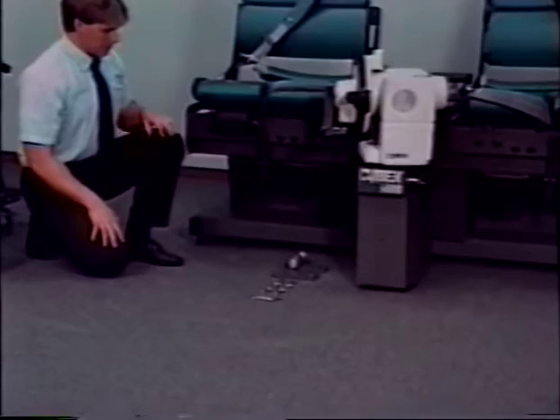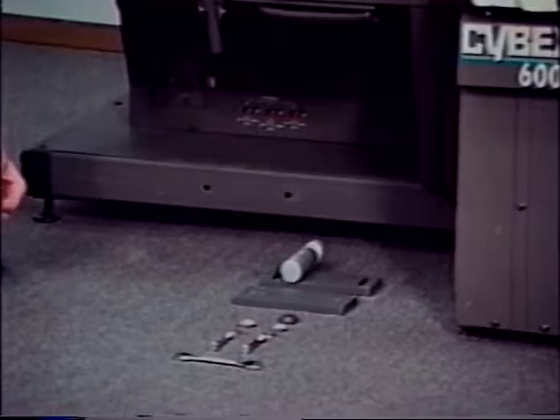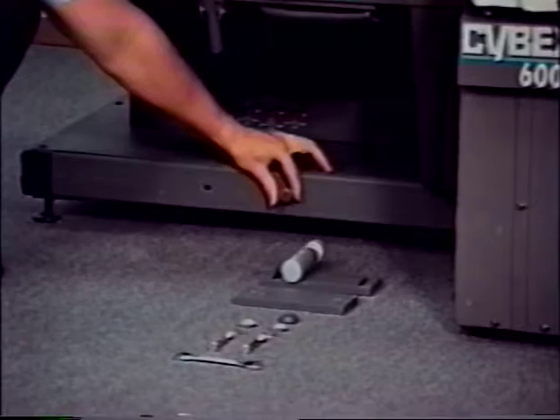Remove all shipping and banding materials from the TEF modular component. Locate the two holes in the front base frame rail of the side of the Cybex 6000 to which the TEF modular component will be mounted, opposite of the monitor. These holes may have plastic plugs or screw caps covering them. Remove as necessary.